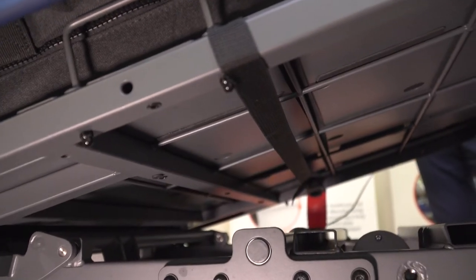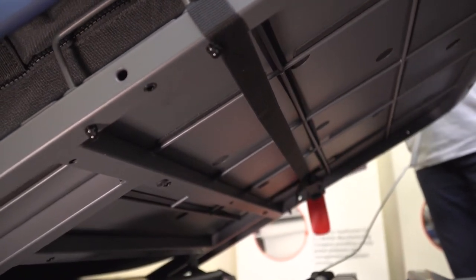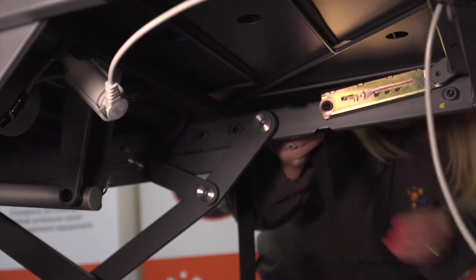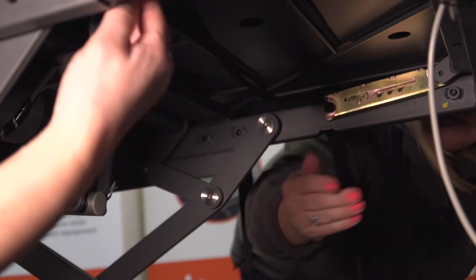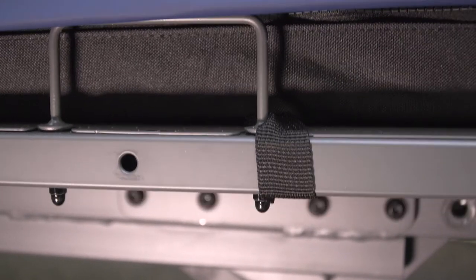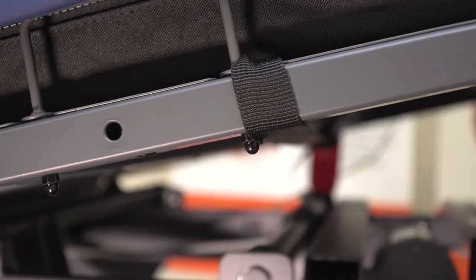Upon installation, it's important to ensure that the securing straps are attached to the moving parts of the bed frame — for example, the knee break and the backrest. Never secure the straps to the outer edges of the bed frame, as this will damage the mattress and the bed.